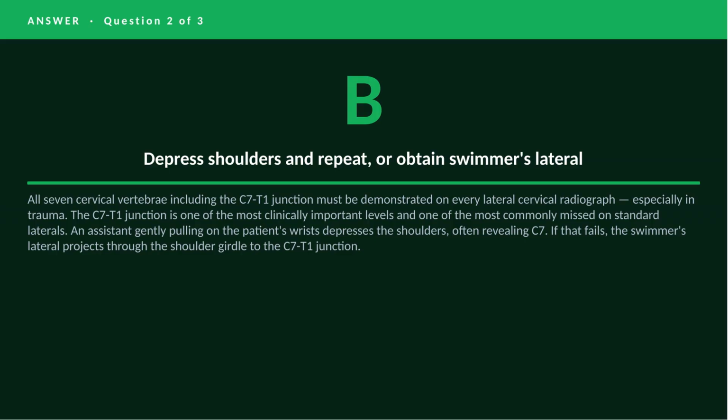The C7, T1 junction is one of the most clinically important levels. A study is incomplete without it.